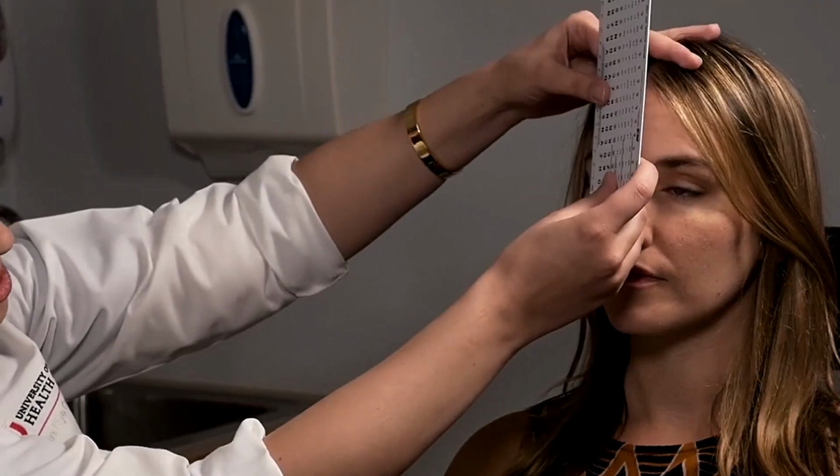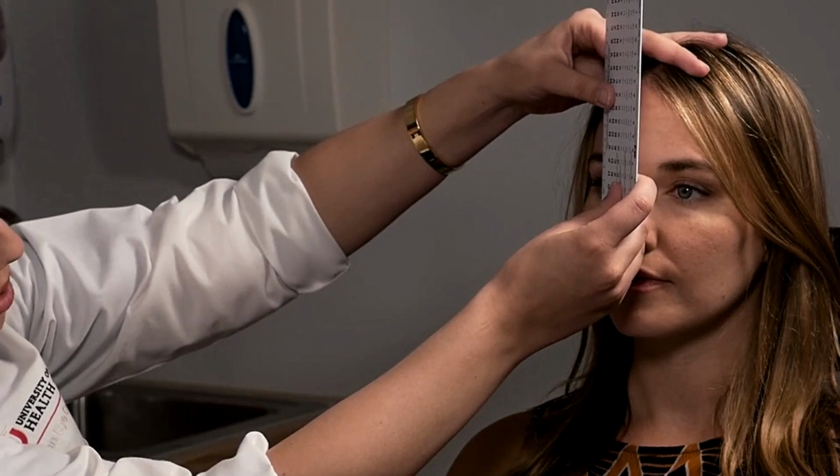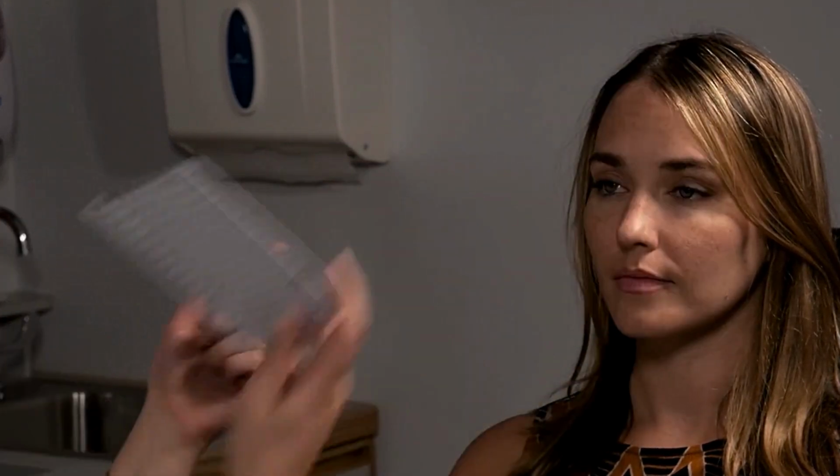You can also measure the palpebral fissure, which is the distance between the two lid margins. So again, you just hold the ruler right up there in front, measure between the two, measure both eyes and compare. Typical is around 9 to 10 millimeters.